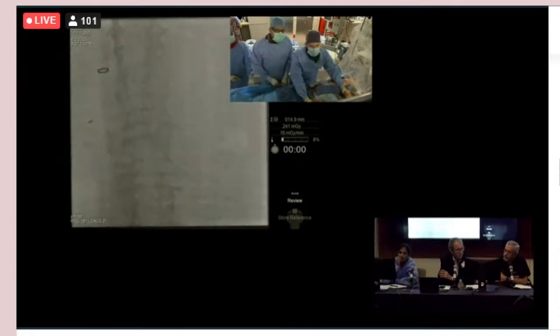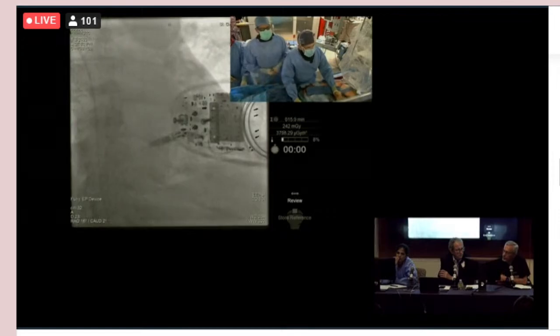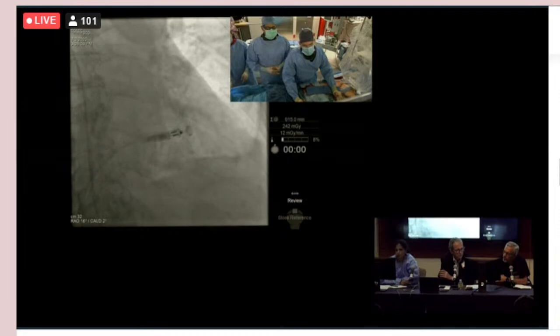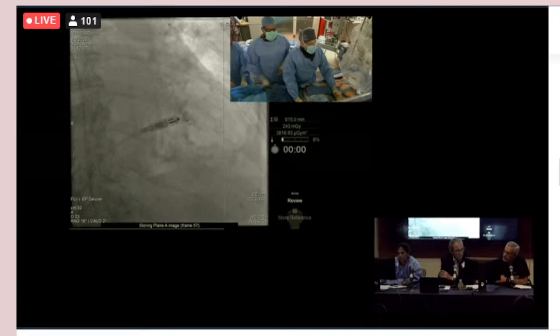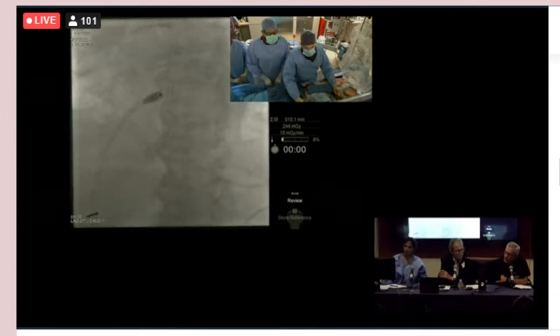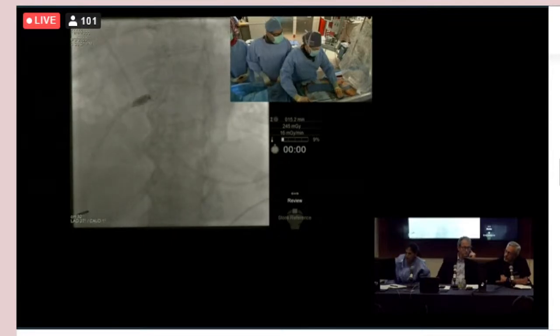Okay. And I'm in the ventricle now, ready to put it in. Okay, so take that out. We're across the outflow tract here, and I like a high septal position. Okay. So this is RAO. Now we're going to go LAO. Deep LAO. Deeper. And now you're LAO, is that correct? Yeah, we're LAO 27.